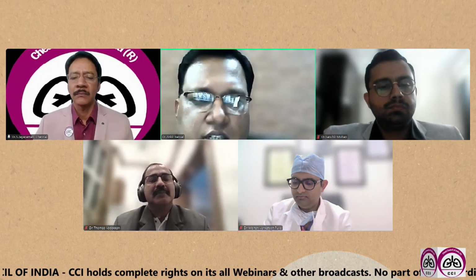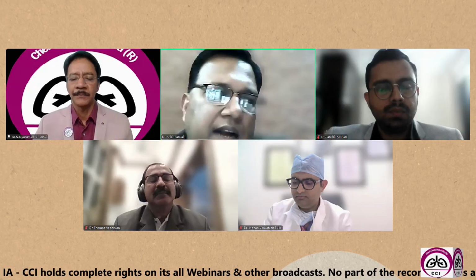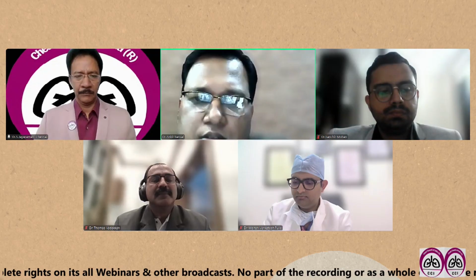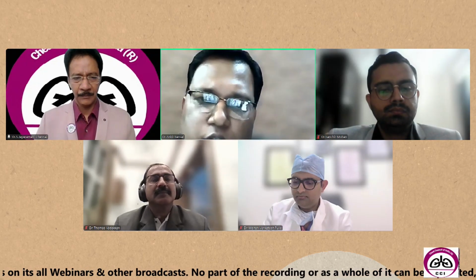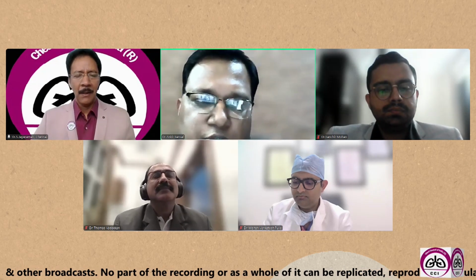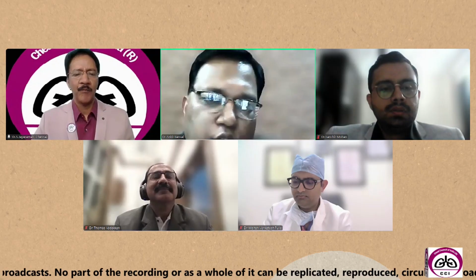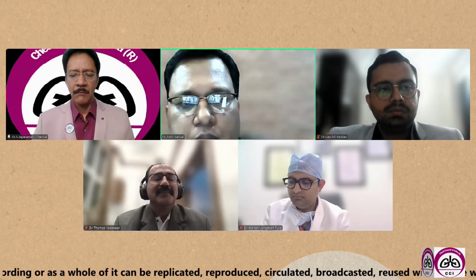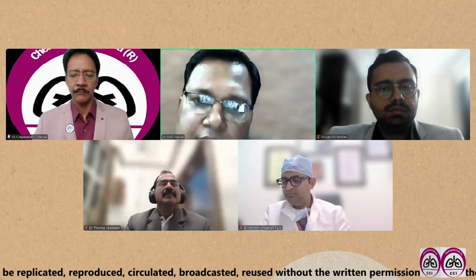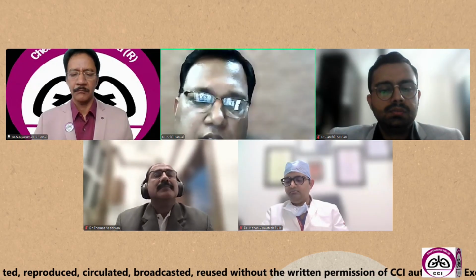Sir, of all the stations, I think station 7, the subcarinal lymph node, is the foundation station we should master first. Why is it so? It is a central anatomical anchor. It is a junction of both lungs. A midline reference is good. Upward you can go to 4R, 4L. Downwards you can go to 10, 11. It shows the best CT-EBUS correlation because it is easily recognized. The pulmonary arterial bifurcation is consistent, and anatomical variability is minimal at this station.